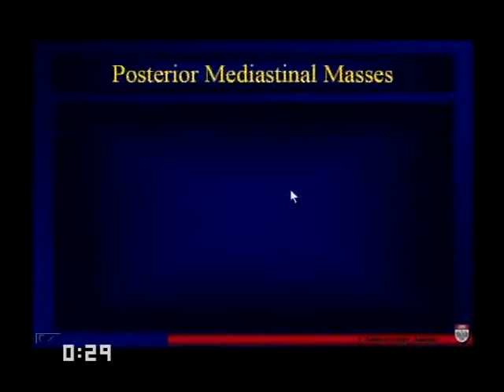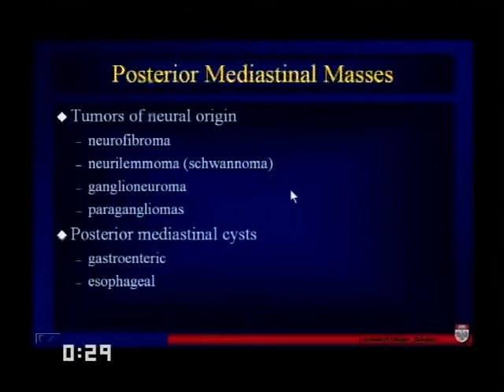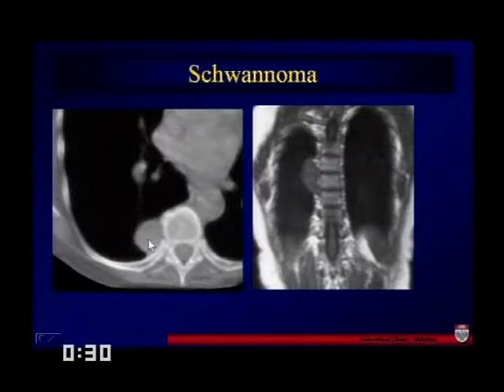Wrapping up in terms of the posterior mediastinum, most of these things are going to be neural in origin. Sometimes they may be associated with the esophagus, or we might see extramedullary hematopoiesis. This is a case of a posterior mediastinal mass — neural in origin, a schwannoma. You can see on both MR and CT that it's in the paraspinous area.